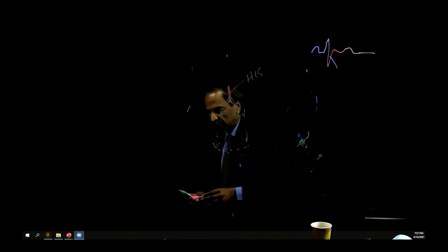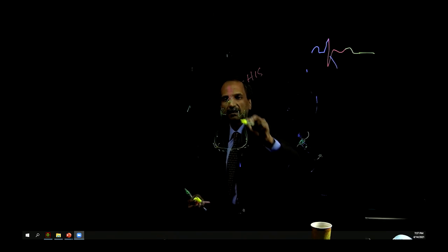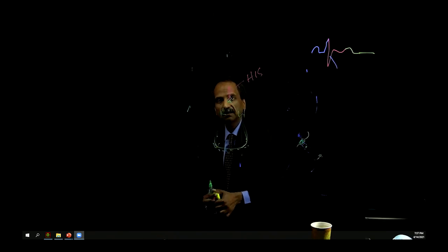Now, just to emphasize why bundle branch reentry was not the diagnosis: in bundle branch reentry, it goes right bundle, left bundle, retrograde left bundle, antegrade right bundle, completing the circuit. The His itself is not part of this circuit. The circuit involves the bundle branches. So right bundle, left bundle.